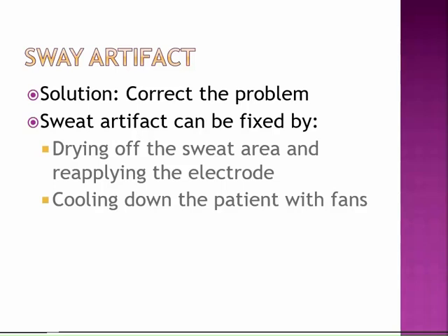You'll see in your textbook, it does say that you can take the electrode off, dry the area, and reapply it. I can say I've never seen this done in any professional circumstance. I'm not going to wake the patient up, dry off each individual electrode spot, and then reapply it. The only time this has ever happened is in summertime. A patient comes in sweating heavily, and as soon as you put the electrodes on, they just melt right off. So some techs even keep a little antiperspirant in their locker to put on the patient's scalp to stop them from sweating so they can get their electrodes placed.